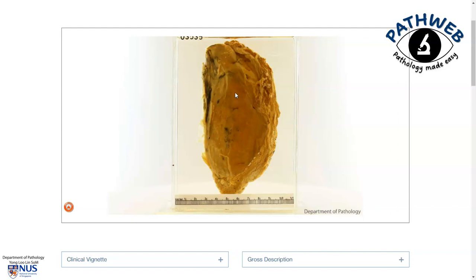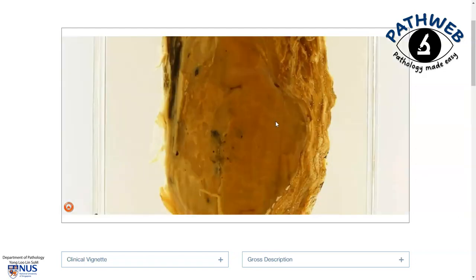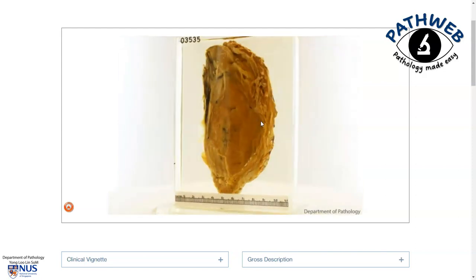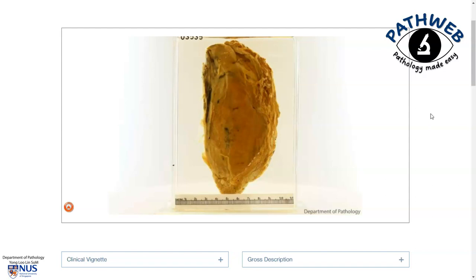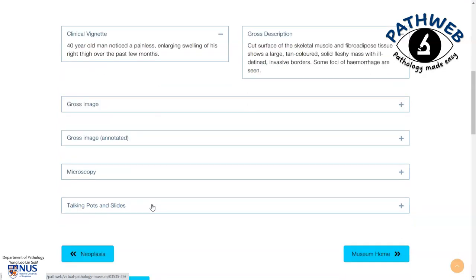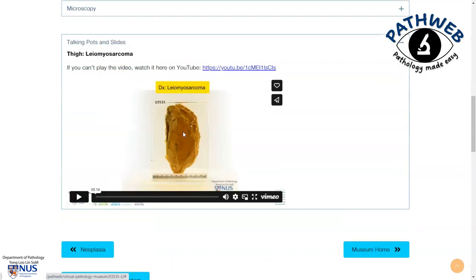This page in our virtual online pathology museum, PathWeb, shows a gross example of leiomyosarcoma where we can see this relatively well demarcated tumor mass located in the soft tissue — this particular tumor is arising in the thigh. If you scroll down this page you will also be able to expand clinical vignettes, gross description, and view other annotated images as well as a brief video on the gross appearance. To access this virtual pathology museum simply click on the link in the video description.